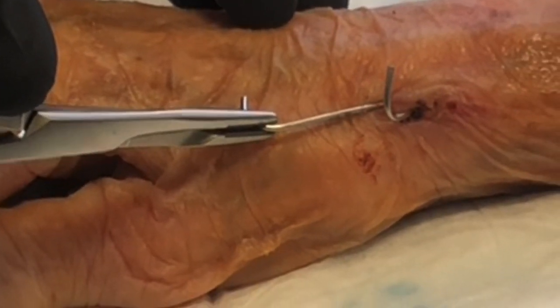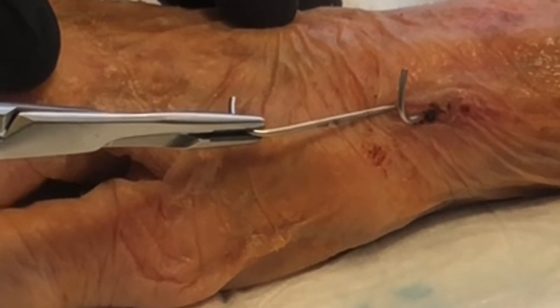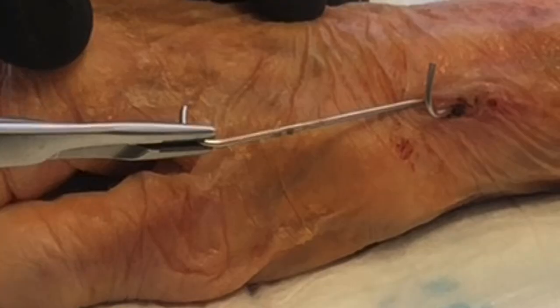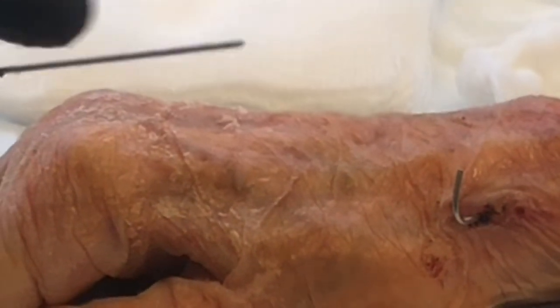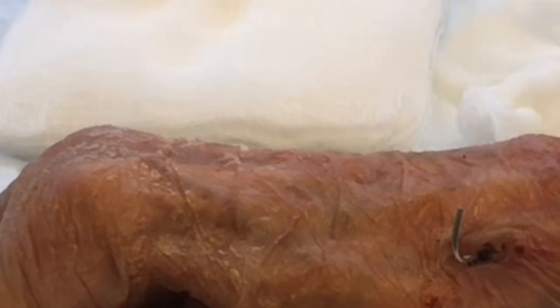They have a sharp tip, and when they're put in, they're drilled in with a drill — I drill them into the bone through the skin. They have a sharp bevel-type trocar tip, so they're drilled into the bone.